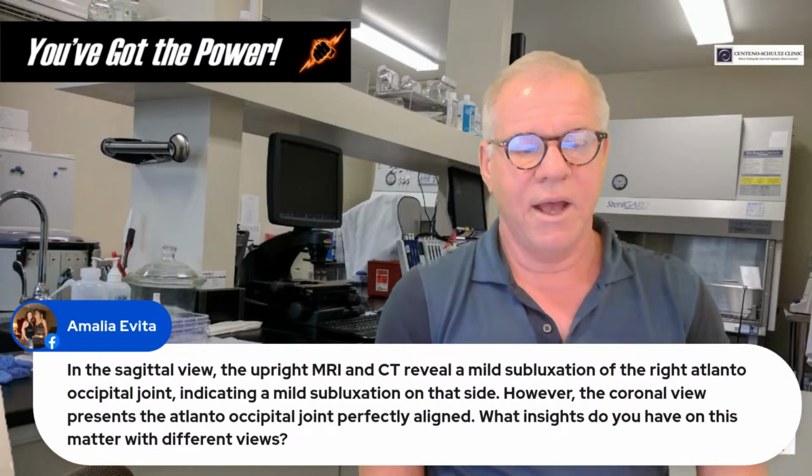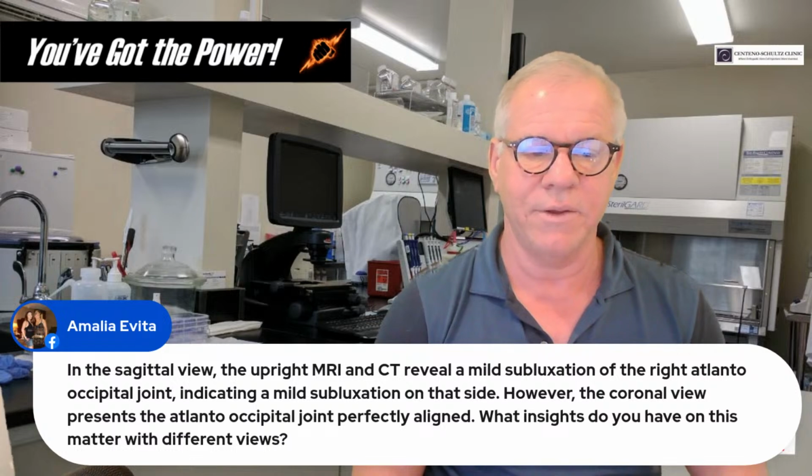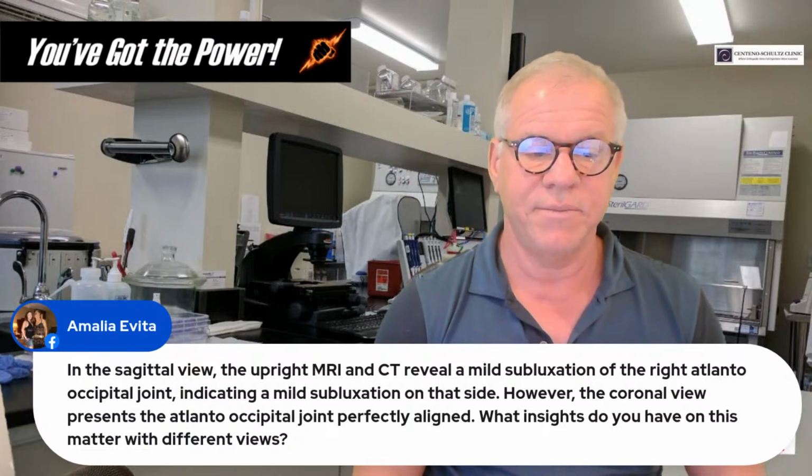Amalia, in the sagittal view, the upright MRI and CT reveal mild subluxation of the right atlanto-occipital joint, indicating a mild subluxation of that side. However, the coronal view presents the atlanto-occipital joint perfectly aligned. What insights do you have on this matter with different views?